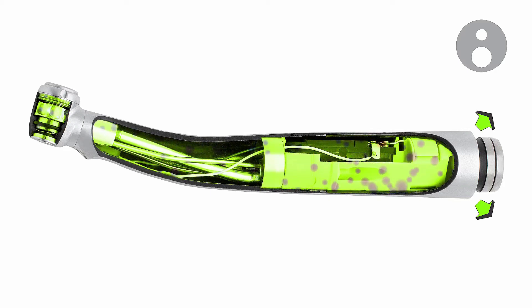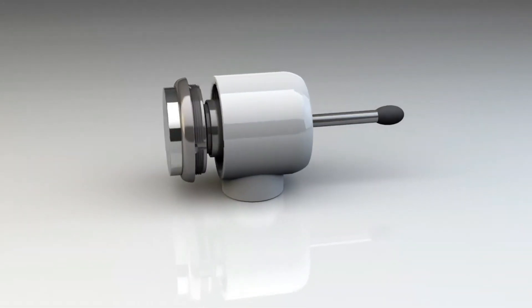Air-driven dental handpieces contain an air turbine in the head. When compressed air delivered through a tube is forced through the blades of the turbine, the movement of the turbine converts that air pressure into the rotational force that makes the chuck, which holds the cutting burr, spin.